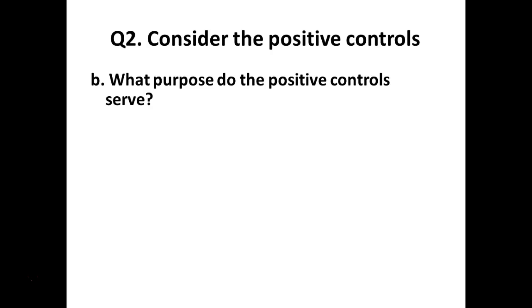Yeah, make sure our test results are accurate. We know what they look like. That we perform the test properly, or the test itself is working properly, right? Does the pregnancy test have a built-in control? Yeah, it's why you get 2 lines when you're pregnant. One is the control well, the control line. The other is your test sample. 1 line, control worked, you're not pregnant. 2 lines, control worked, and you're pregnant, right?